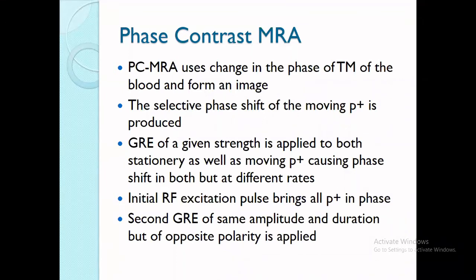So what we are applying here, the initial RF pulse will bring all of the protons in phase. By all of the protons, I mean the stationary protons as well as the moving protons. All of them will be excited and the change will be equal for all of them. So they will be in phase.